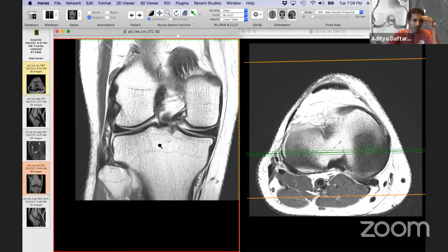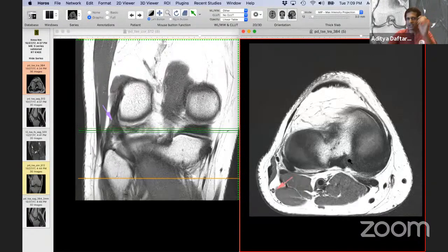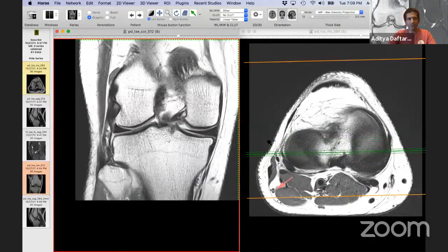As we get a little further behind, one of the things that everybody wants to see is oftentimes the popliteofibular ligament. So here you can see the popliteus tendon, here you can see the fibula, and here you can see this ligament going across, which is the popliteofibular ligament, or a condensation of the posterolateral capsule. So this is for your PLC structures.